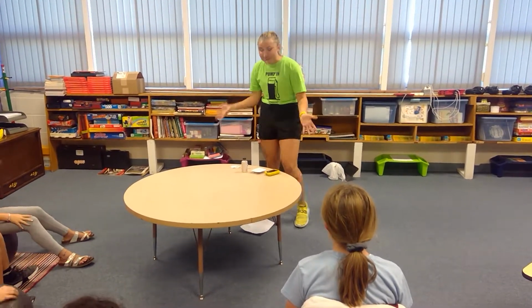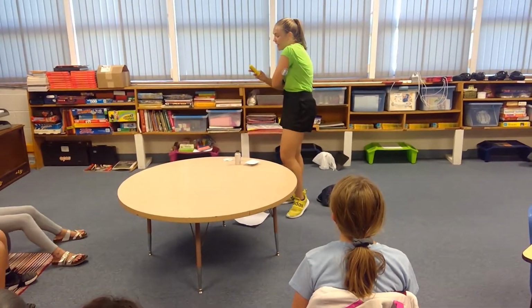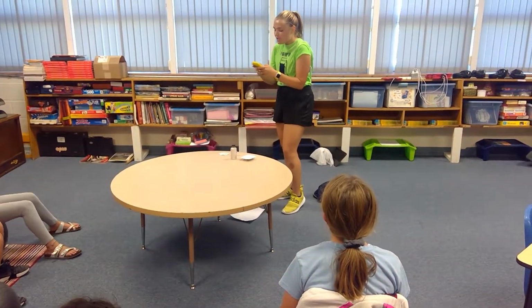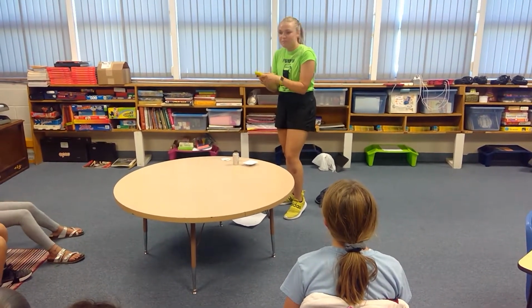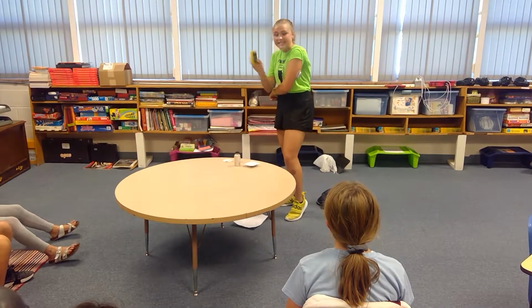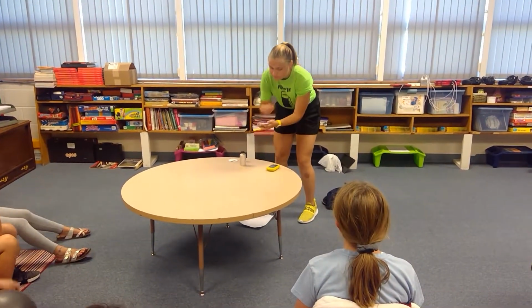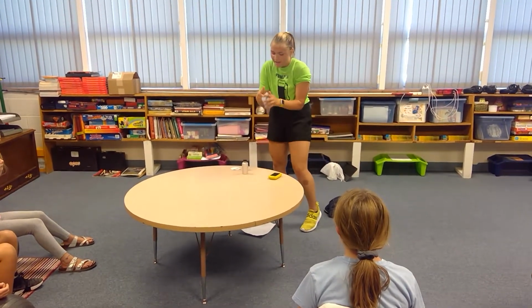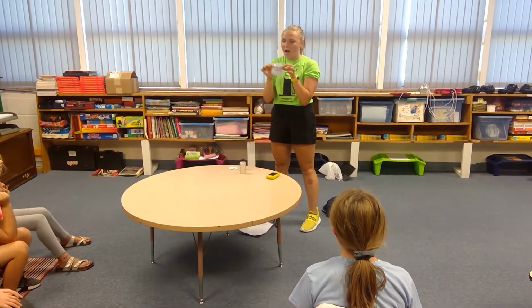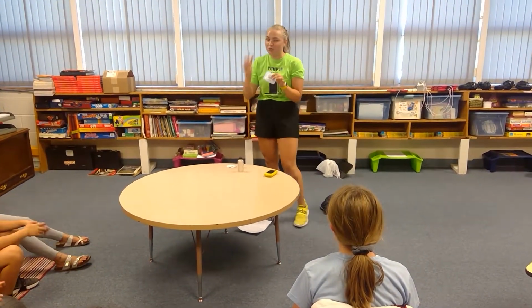That's okay. So the first thing we're going to do is I'm going to have to deactivate the pod I already have on. So what I'm going to be doing is basically turning this one off so that I can put on a new one. So now that it's deactivated, we're going to start with our new pod, which this one can be removed. I'll remove it in just a second. But so next, this is a new sealed pod. So this pump can be thrown away, and I have to use a new one every 3 days.